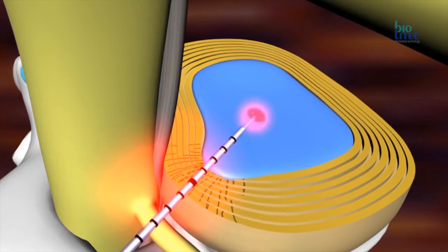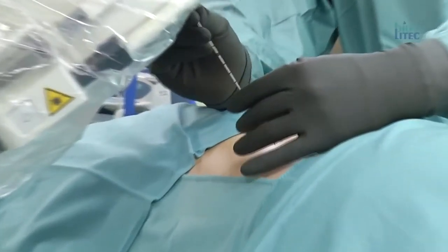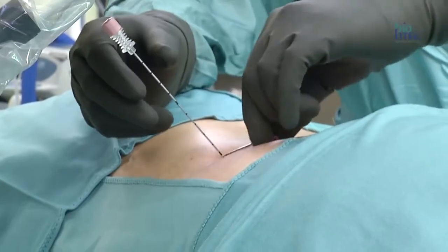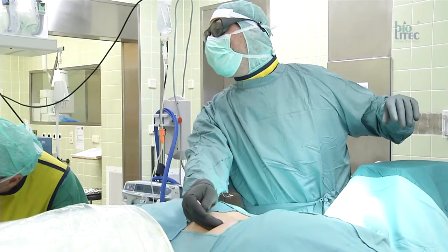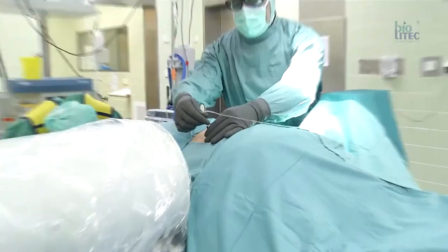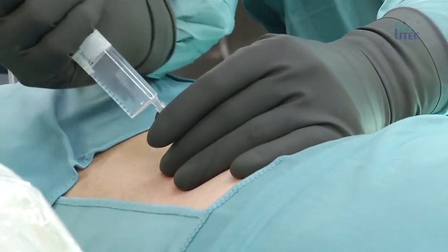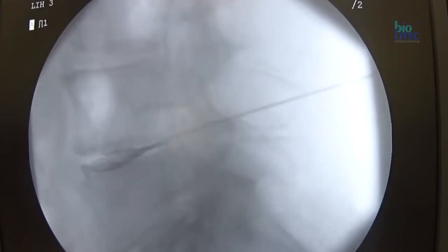The post-nucleotomy syndromes are also very treatable. The nucleotomy at the lumbar spine is carried out with an 18g needle under fluoroscopic guidance after local anaesthesia. The right position of the tip is the dorsal third of the discus. It is important to maintain a parallel alignment of the needle between the vertebral bodies. The right position should be controlled in AP and lateral view. A discography with contrast medium leads to further information about the condition of the discus. A memory pain test, which is a provocative test because of an intradiscal pressure increase, is also a good diagnostic tool and is routinely performed before treatment.